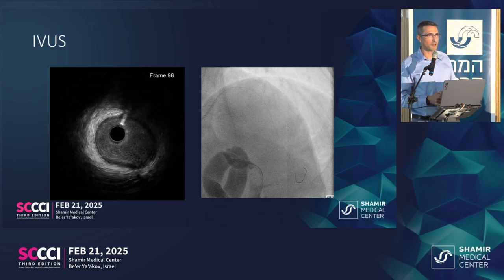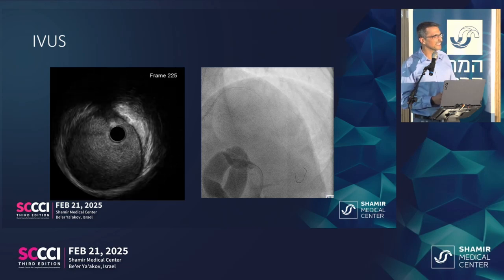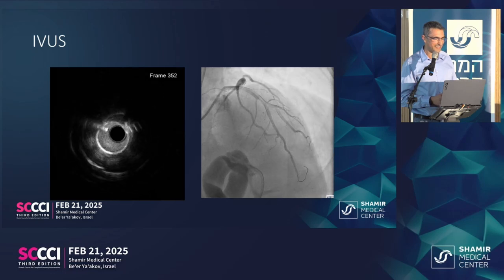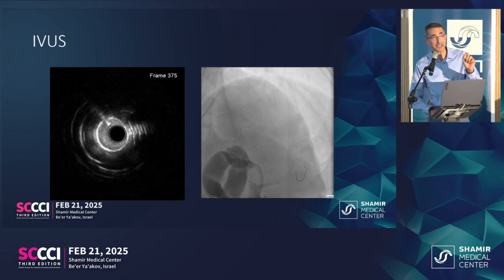The stent was in the mid-distal LAD. Where's the stent? So this is where the stent is. The stent is here, in the left main. Yeah, okay. Yeah, that's exactly what I said.